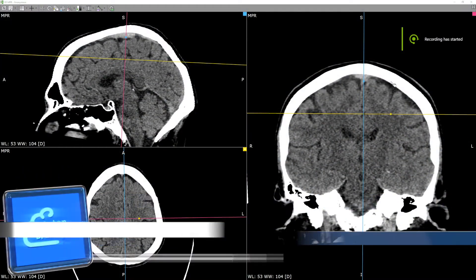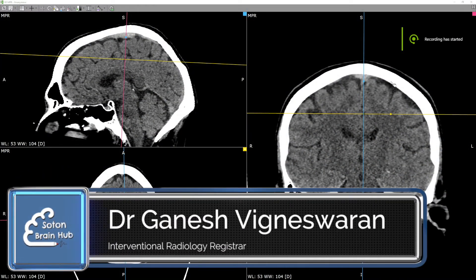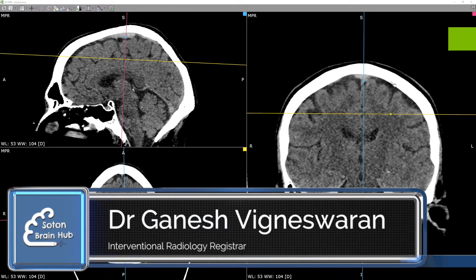In this tutorial we are going to touch on the basics of a CT head interpretation. Here we have an unenhanced CT head.